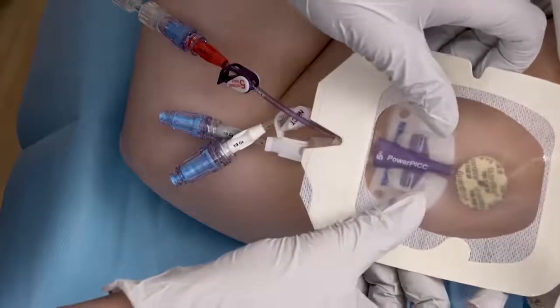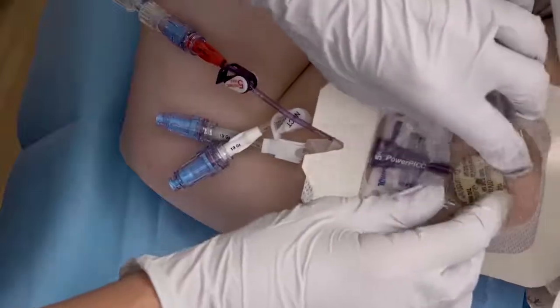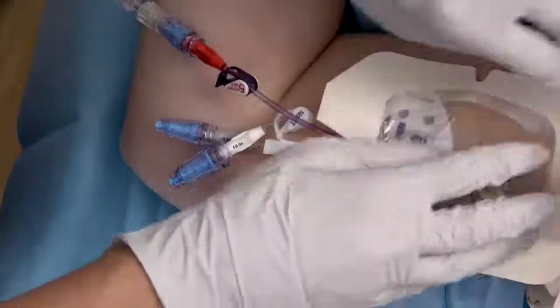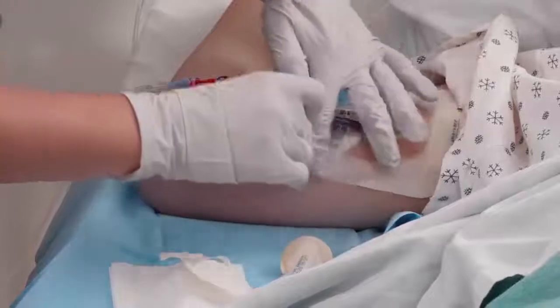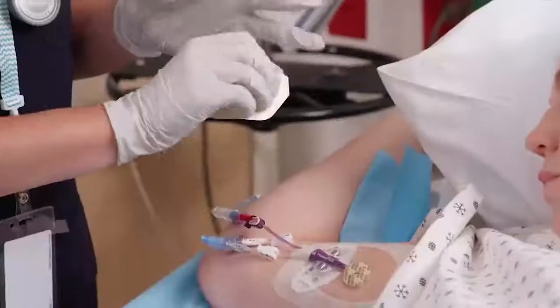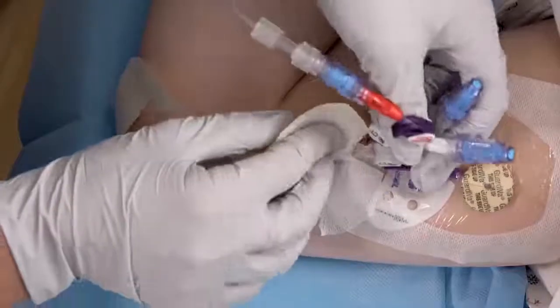Then, apply a transparent semi-permeable membrane dressing. Align the center of the dressing to the insertion site, having adequate dressing borders on all edges. Assure all edges are secured well to the skin. Complete dressing by applying the extension leg strip for final tape.